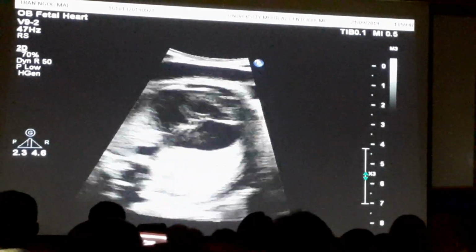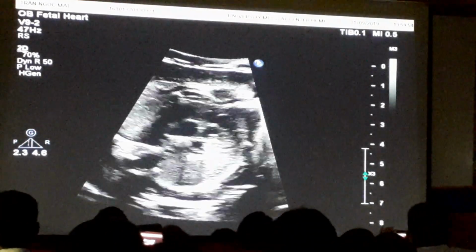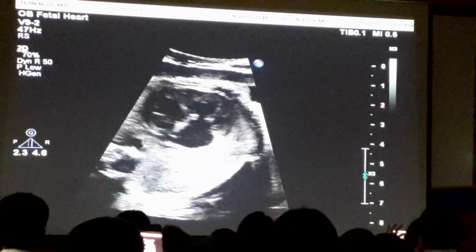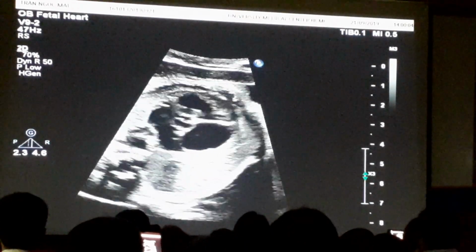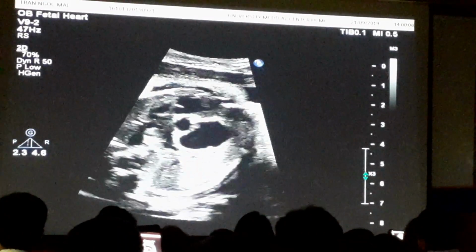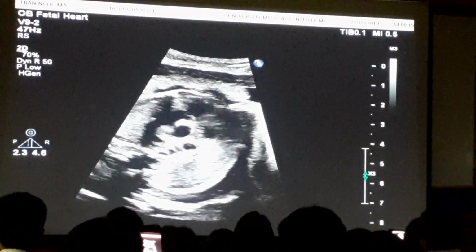So overall, with respect to this fetus, I don't see any effusions. I just see the cardiomegaly and the right atrial enlargement, which is probably due to this tricuspid valve dysplasia. In addition, there is evidence of increased afterload without any structural RV outflow tract obstruction. And this is all in keeping with a resolving twin-twin transfusion cardiomyopathy.